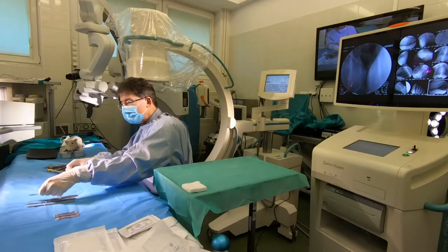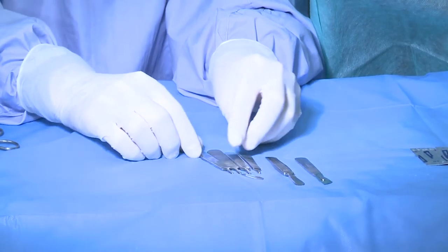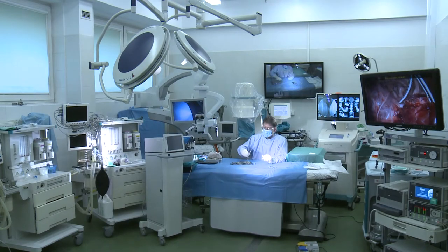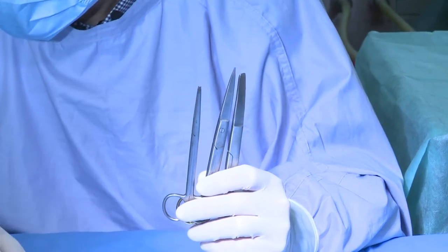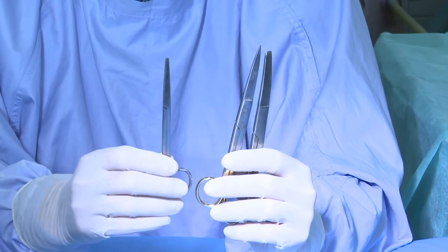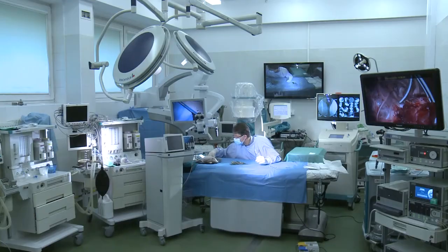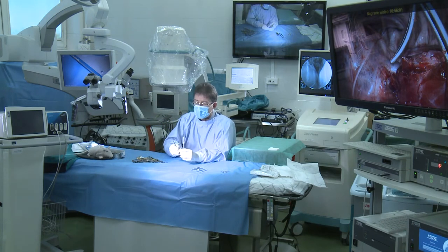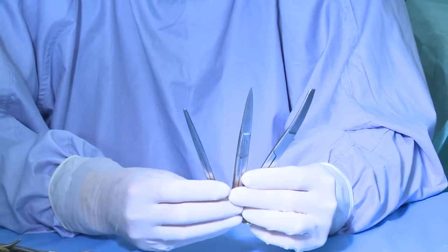Another equipment for cutting are scissors. We have some of them here. These scissors are different — we have altogether a great number of scissors, and I will also show some in another part, including very small, delicate ones for microsurgery purposes. But that is the topic of our meeting regarding microsurgery. We have three different scissors among many kinds.